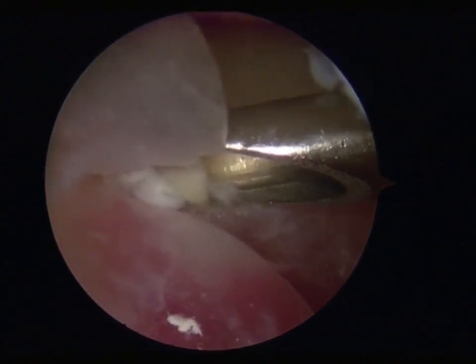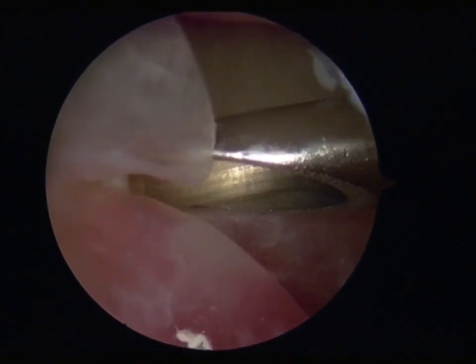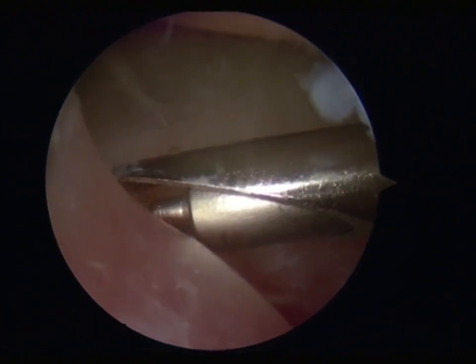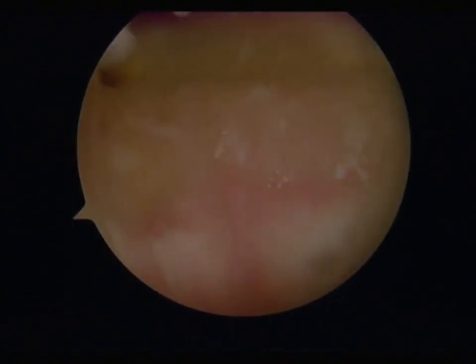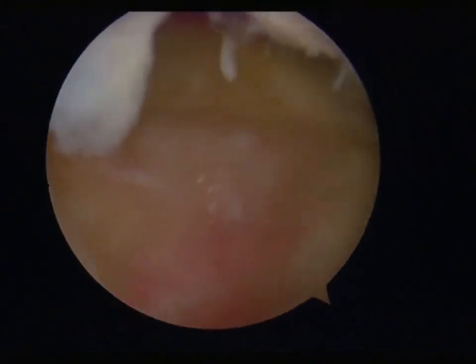An absorbable nail with the Roman column structure was inserted. Repeat the steps of inserting nails and insert a total of three absorbable nails at different locations to complete the fixation of the porcine peritoneum. The condition after fixation is shown in the video. The surgery is almost completed and the subsequent steps such as closing the surgical incision are omitted.